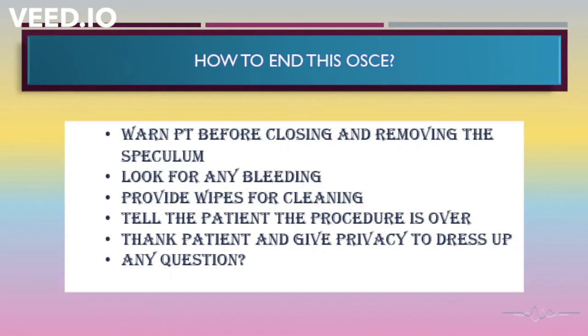Another point I would like to make is for the labeling of the sample. You can do it at this point when you're asking the patient if she could dress up. So during that time when you're giving privacy, that is the time you can do the labeling. And after the labeling, ask the patient if they have any further query, if they are feeling any pain, discomfort, or excessive bleeding. And it is always good to end any station with some safety netting.